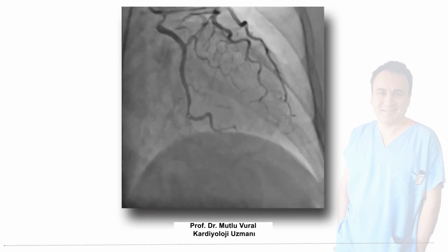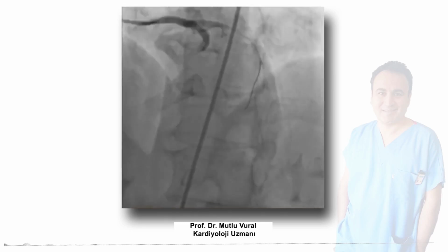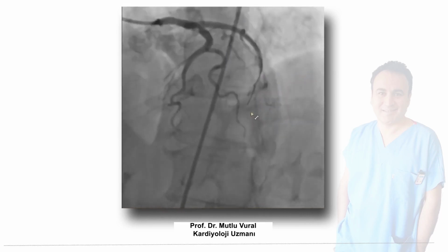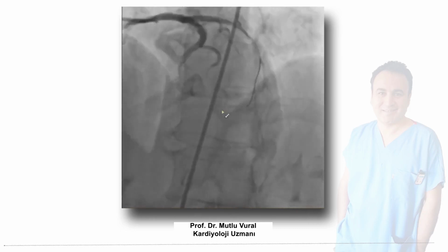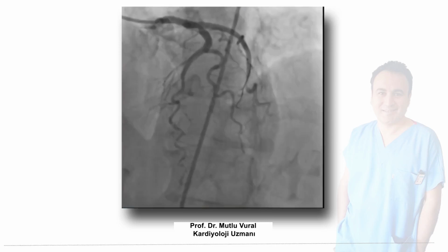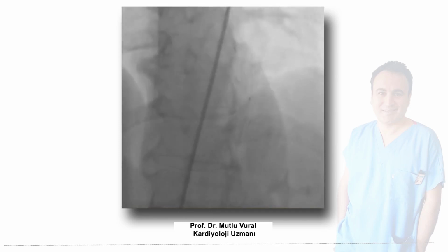The only need was stenting of the OM branch here, but my colleague thought that there was a big branch there, tried to recognize, but as you see, the tip of the guide wire, it is very freely floating.